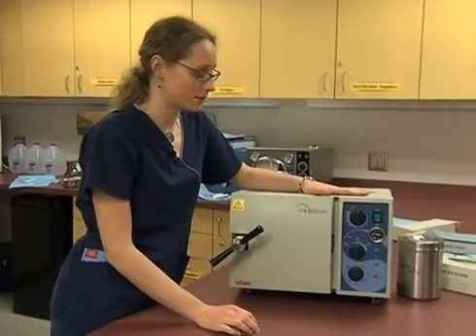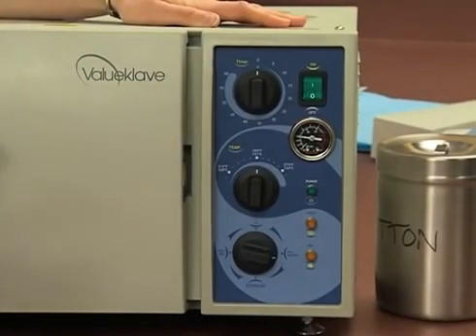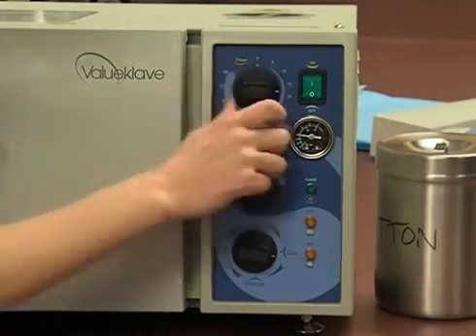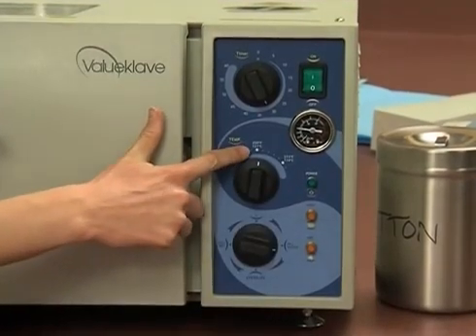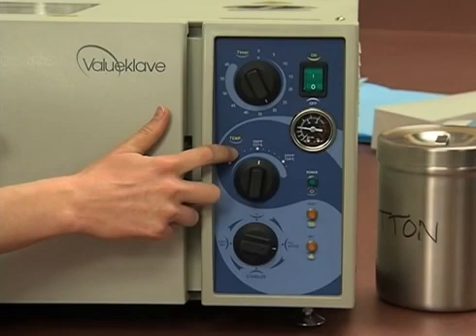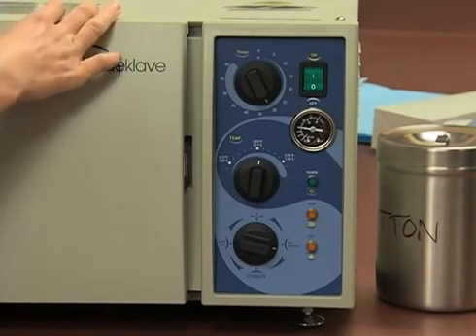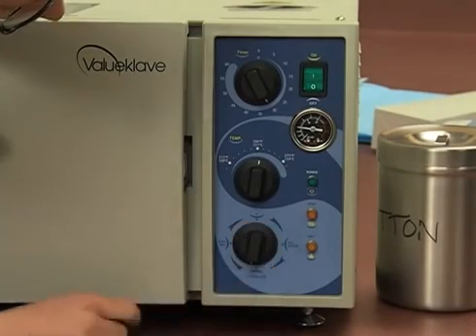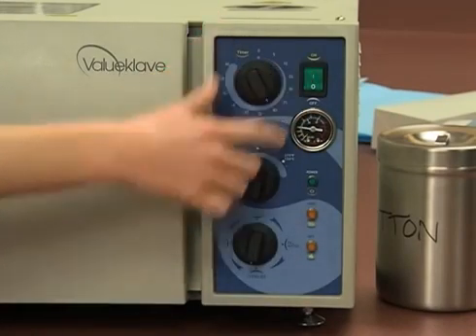Before we turn it on, we're going to get everything set. One of the issues is time. For general packs and wrapped items that need to be sterile for surgical procedures, we want to make sure that they've at least been sterilized for 30 minutes. So we could turn our dial to 30 minutes. We also want to make sure that they at least get to 250 degrees Fahrenheit or 121 degrees Celsius. The manufacturer will give recommendations for different types of wrapped items. And then we'll turn the dial to sterilize and turn on the autoclave.